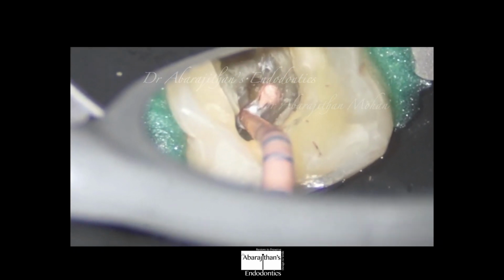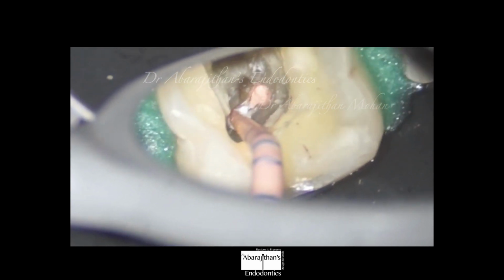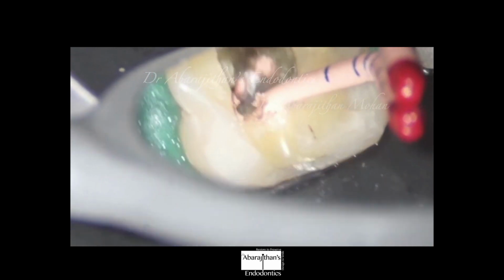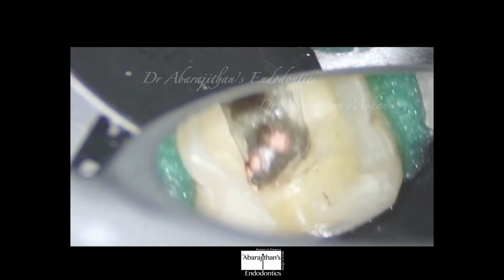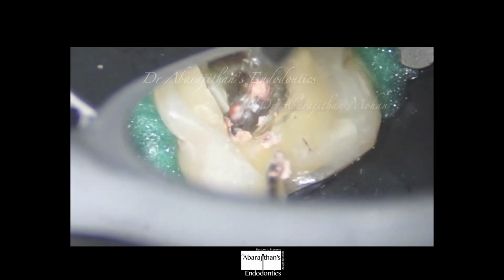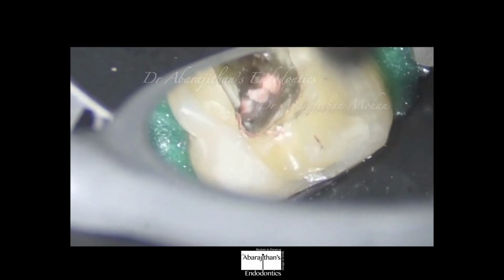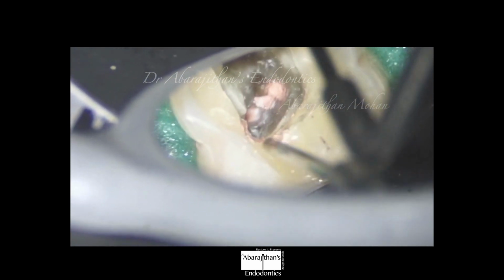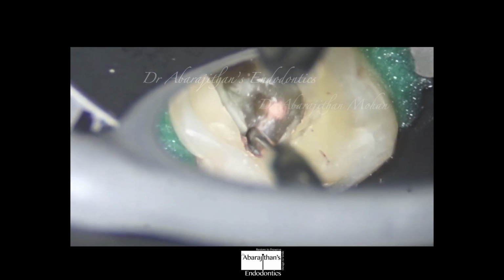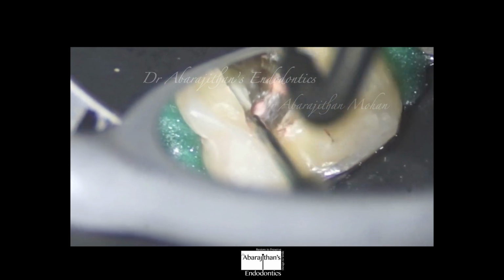So after placing the master cone, you can see the down pack unit is used to first shear the GP. You can see a passive down pack is being done. So everything is under control apart from your better ergonomics, which is good for the health of the operator. You are also able to perform procedures at the highest level of precision.